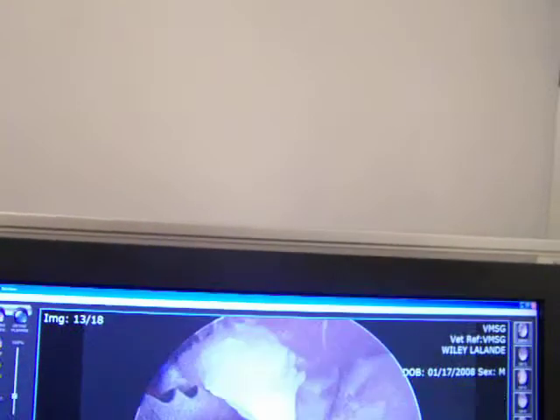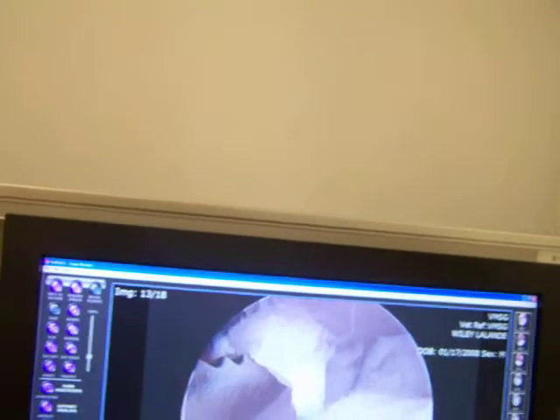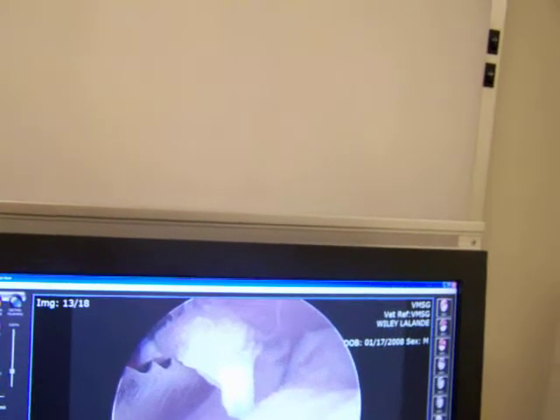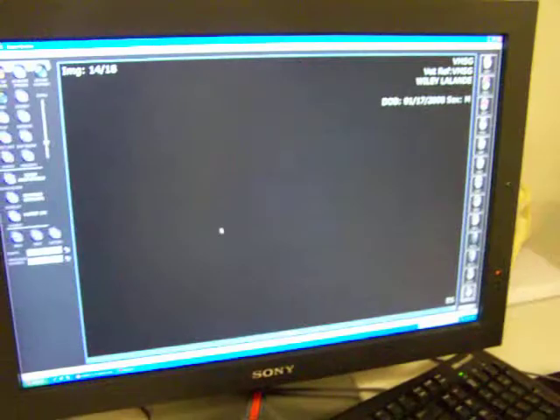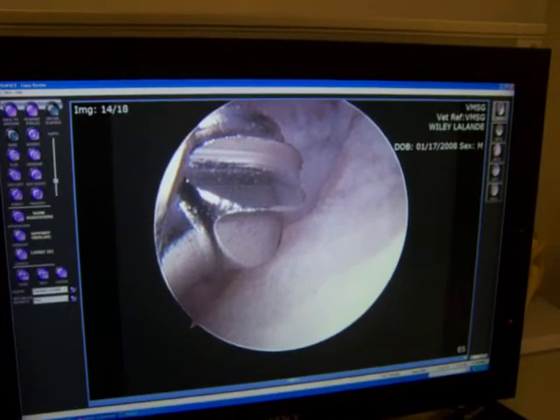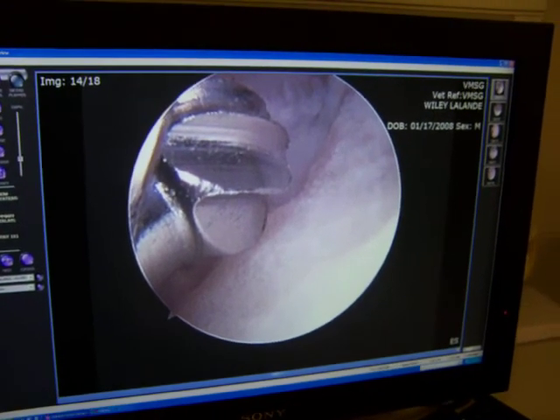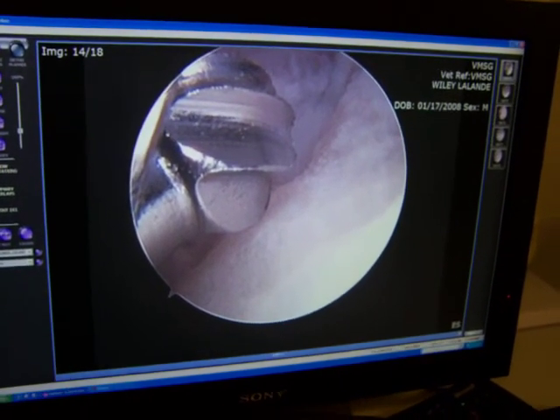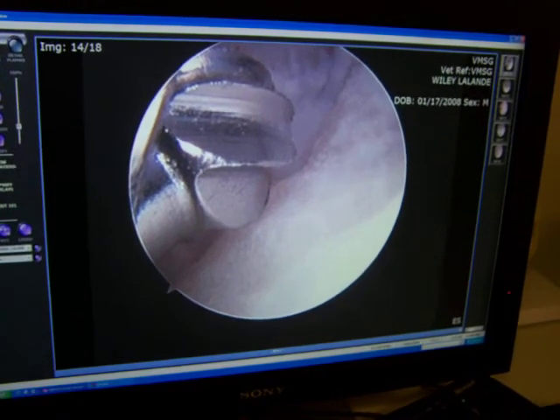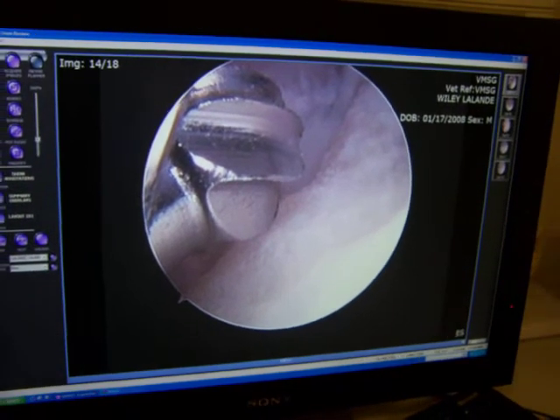You can see the bottom of where the lesion was. This bone here was basically sitting like this and we've taken it out. The exposed bone underneath is called subchondral bone, and that's what we drilled into. This is the burr — it looks like a big auger. The crater runs from here across to there, not that wide. I'm using this to smooth out the bone area, remove residual cartilage, get a nice smooth bone surface. It spins and we suction it out simultaneously.